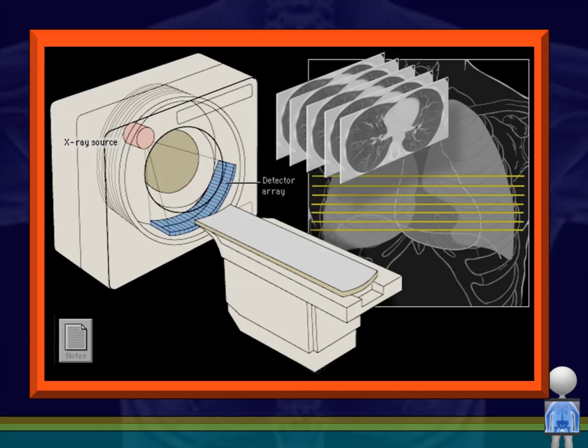The way a CAT scanner works is by using, number one, X-ray technology. Remember that. So the pictures that the CAT scan is going to get us are created using X-ray. Therefore, they are created using density, and that's how my image is formed. It's so important to remember that as we think about when and how we might use these things.